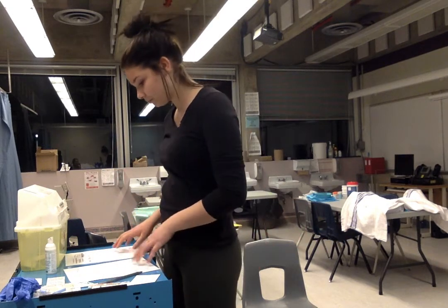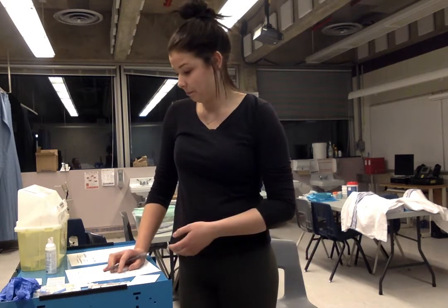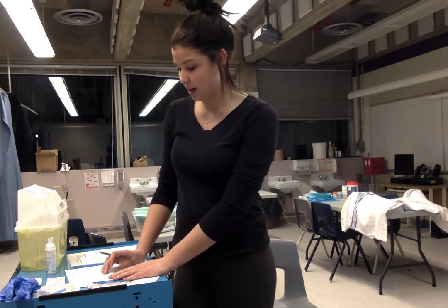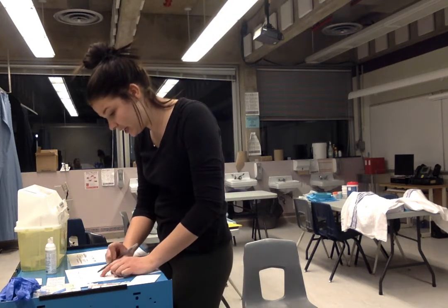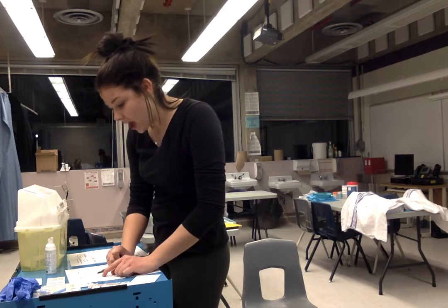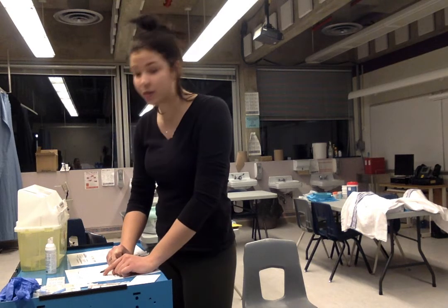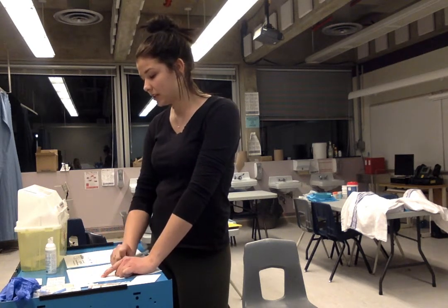So then as far as the drug order, today we're going to be doing his PRN morphine. I am making note that he has other drugs that he's given throughout the day. I have made note of when in my shift I would give them, but for the purpose of this testing, we're doing the morphine, so that's what we're going to check. So his morphine is 3 to 5 milligrams by IV or subcut, Q2 hours, PRN, may insert a subcut line. So today we're going to be doing that subcut line insertion, so that's how we'll be giving his morphine. So that's on the order sheet.